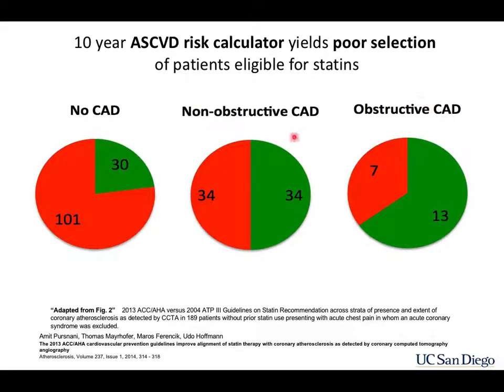They took 200 patients, in 2013, I guess. They took CTs in all of these patients, and they calculated their ASCVD risk for having a cardiovascular event. So now you've got the risk calculated for each person, and you kind of have the answer as to whether or not they are growing lesions in their coronary arteries, right?